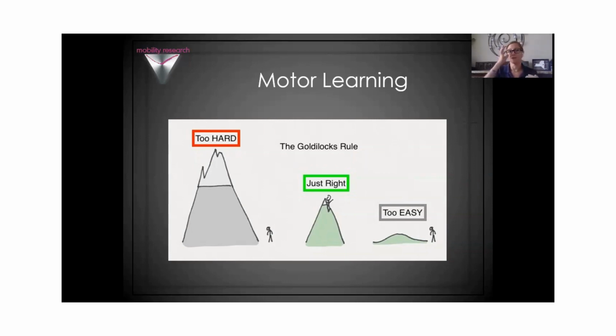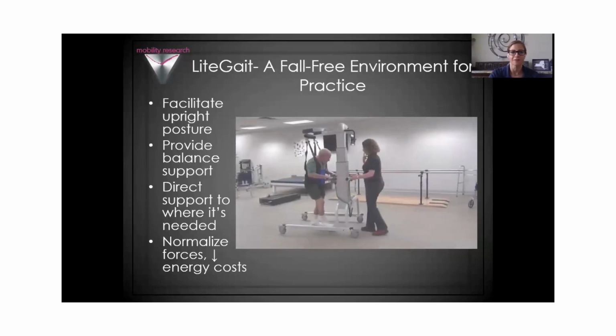One of the benefits of the LiteGait is the ability to not only adjust how much body weight support we're providing, but also really titrate the available degrees of freedom of movement for the client, to really hone in and get that just right amount of practice for our clients.